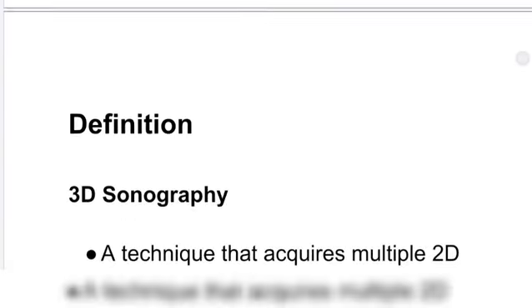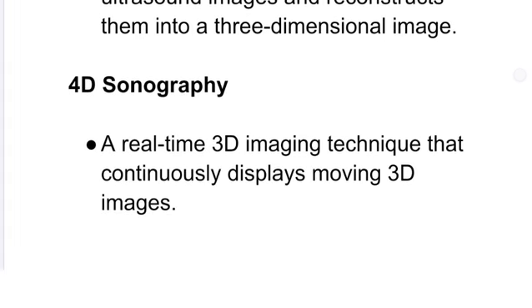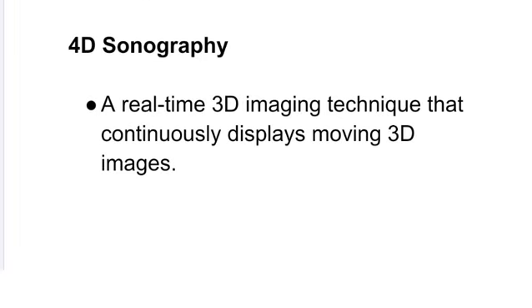Next we are going to look at 3D sonography. 3D sonography is an imaging technique that acquires multiple two-dimensional ultrasound images and reconstructs them into a three-dimensional image. Next is 4D sonography. 4D sonography is a real-time 3D imaging technique that continuously displays moving 3D images.